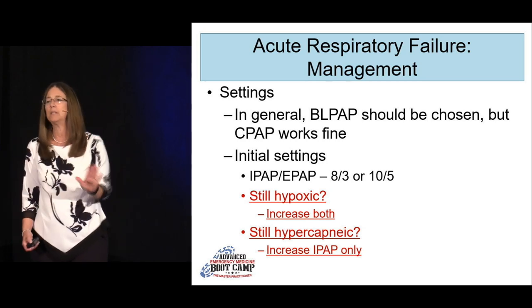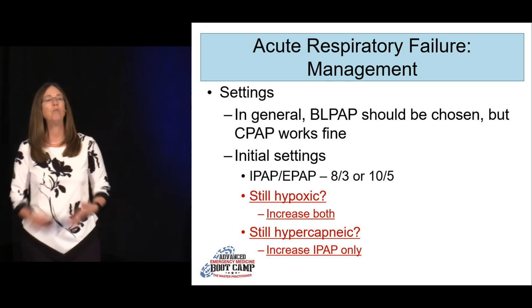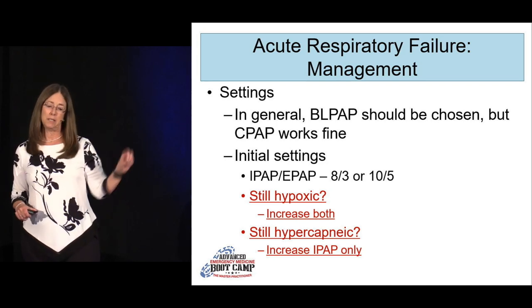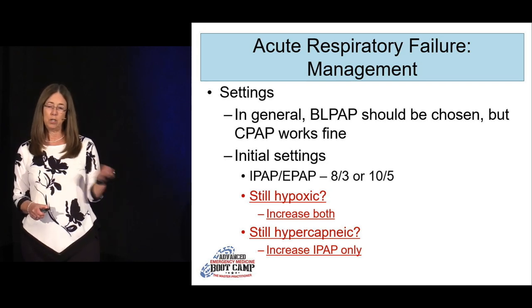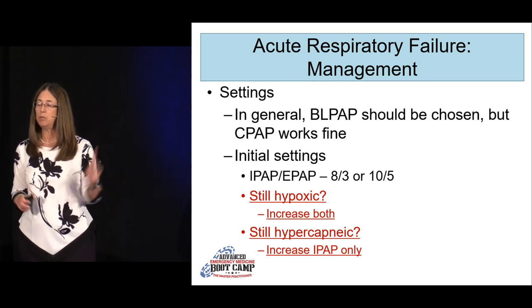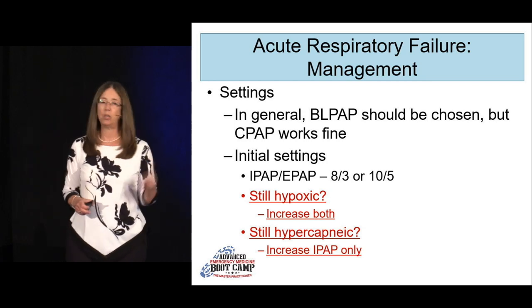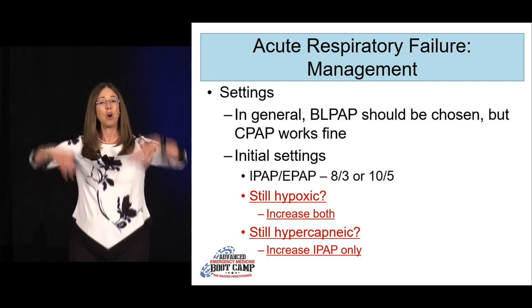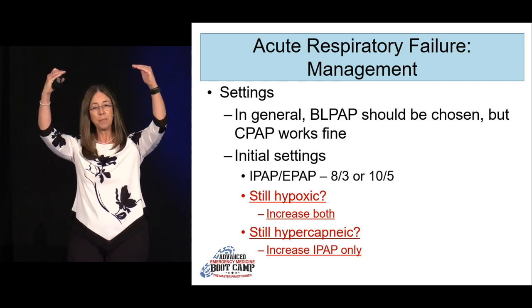Those are simple principles that are really important to improving your success in using non-invasive ventilation. The other thing, as an aside, the only exception to taking those numbers as they are, the initial settings, is what you heard about this morning from Jess. If somebody comes in with acute decompensated heart failure and they are flooded, they are in left-sided heart failure, you're going to start high on purpose.